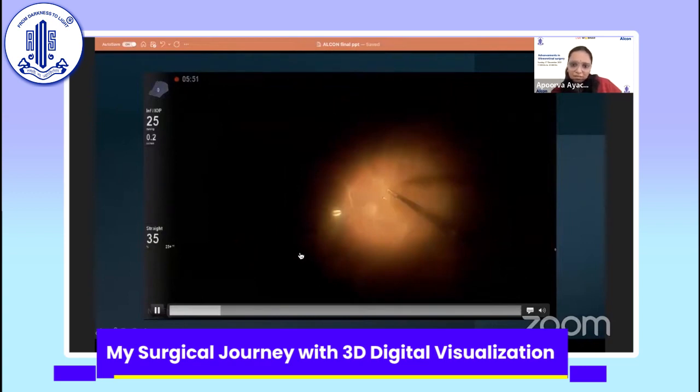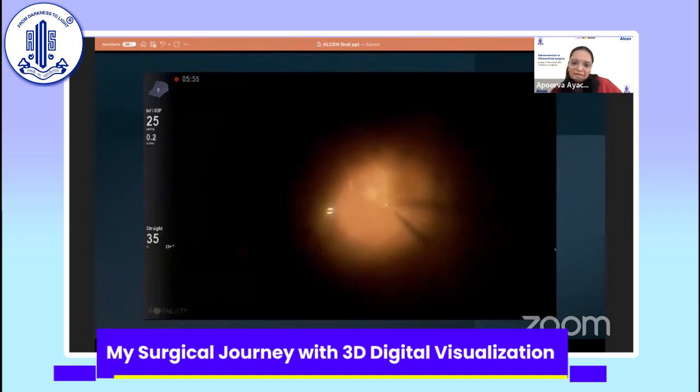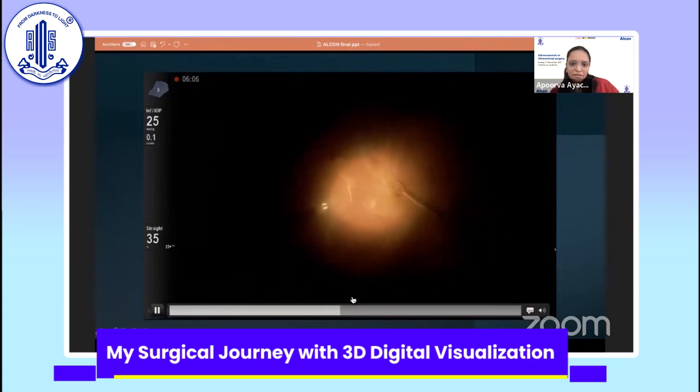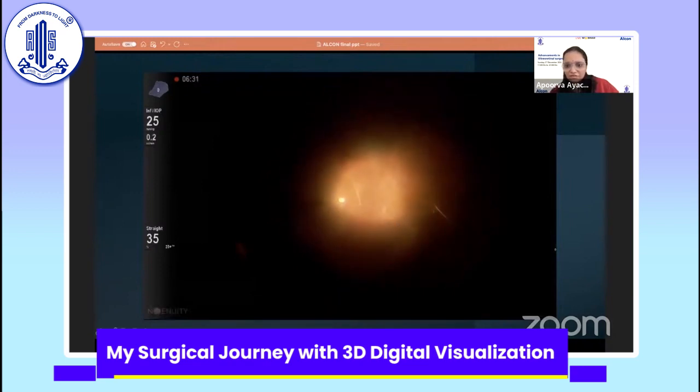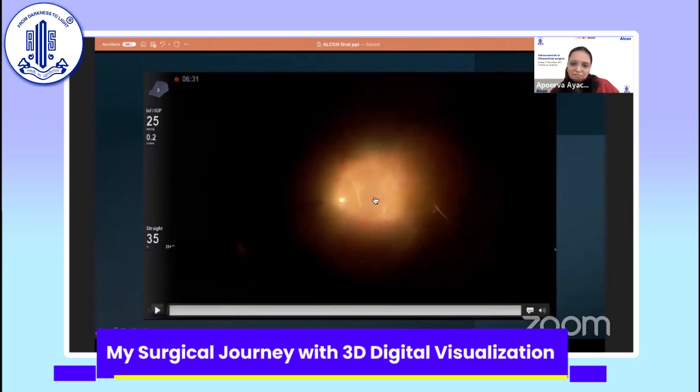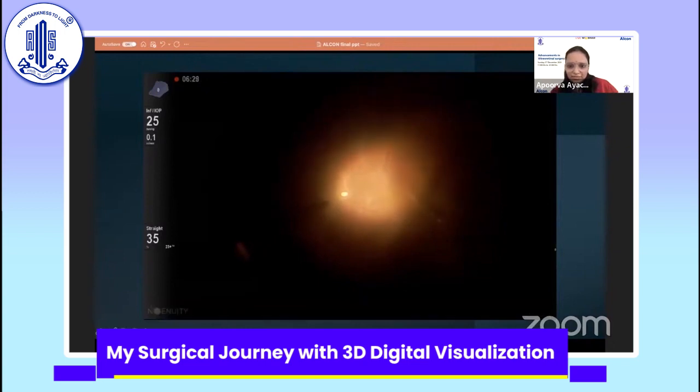So I went in under oil and did under oil removal of these membranes. I'll just show you. Under the oil, I went in with my forceps, with the oil as the infusion itself, and I peeled this reproliferation at the macula. You can see that again this 3D system comes in handy, because the annoying reflexes that are there because of the oil in situ are mitigated by the camera and the image processor. I really believe that this surgery has better visualization on this system than the conventional. You can see I've removed that reproliferation. I did an FAX, removed some more membranes, did an FAX and settled this retina. She's doing well now. This is her only eye.